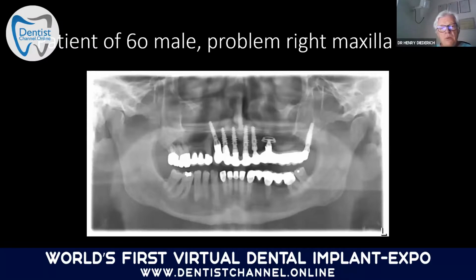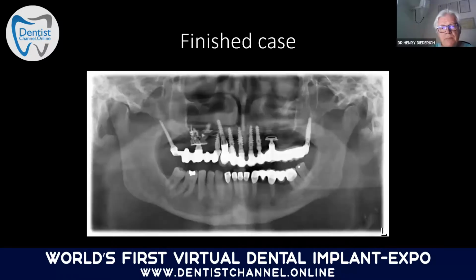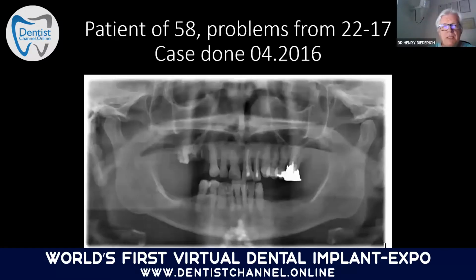Or here also, you see this patient of 60 years old had a problem at the right maxilla. The bridge was broken. And here also we did extraction and implantation. You see the implants in mouth. And here the finished case. Also a minimal invasive procedure. See on the left side, on the right side, our pterygoid implants were doing a great job.